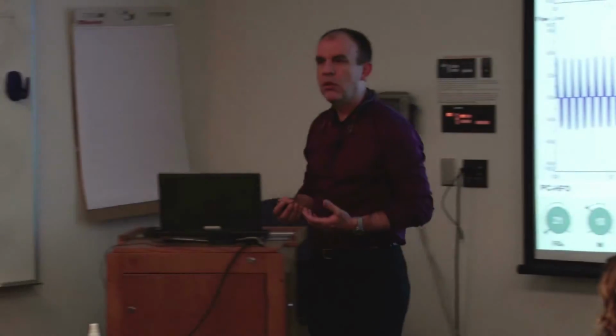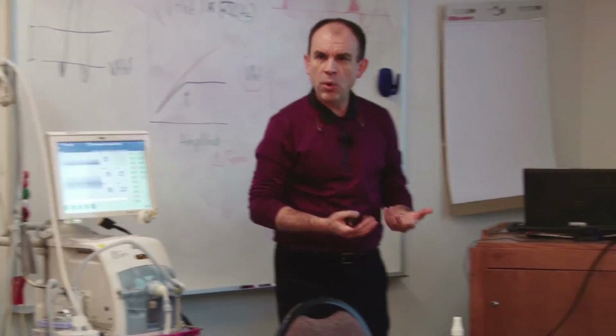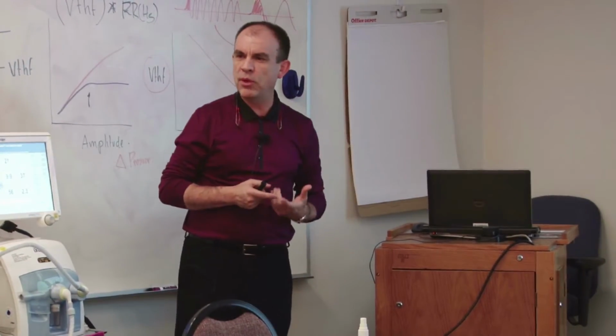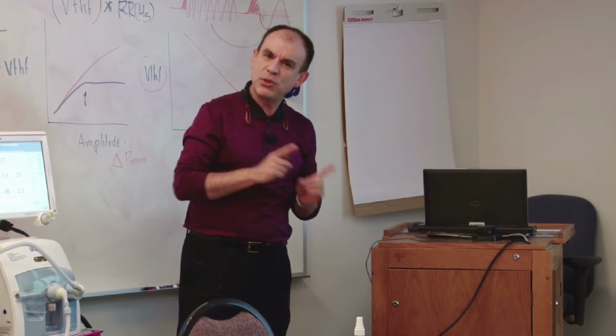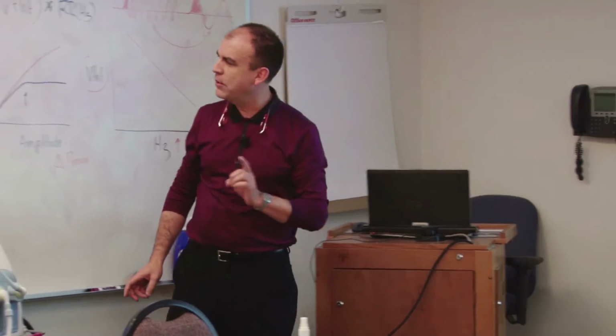That's called volume guarantee in high frequency. It's a completely different mode to what we used to, and it has some drawbacks, but it has something very interesting. Look at the following.